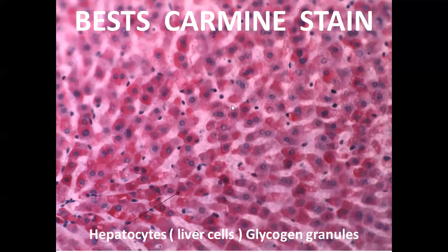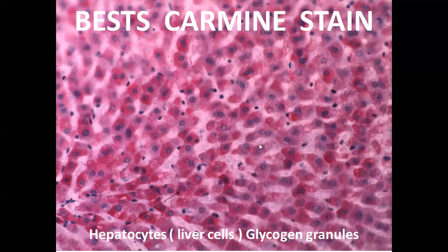In this laboratory about cytology, the name of the stain is very important. Very important, the name of the stain. This is all the information about the cell.